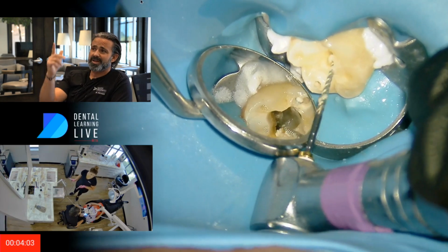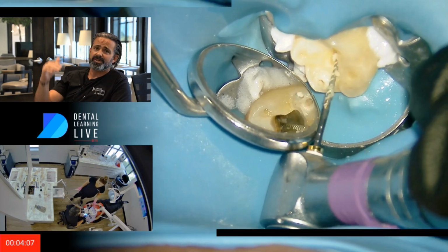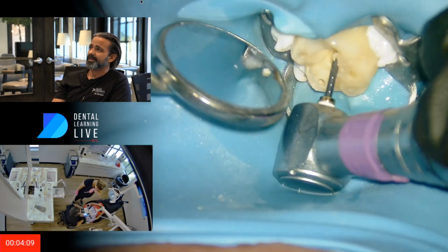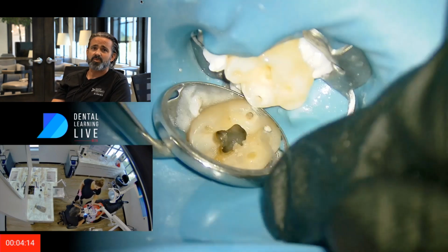And so I'm talking to Lindsay. Down in the bottom left-hand corner is just kind of a bird's eye view of what's going on, and you'll see this is real life stuff, so there might be other assistants walking in and out of the room and stuff like that.